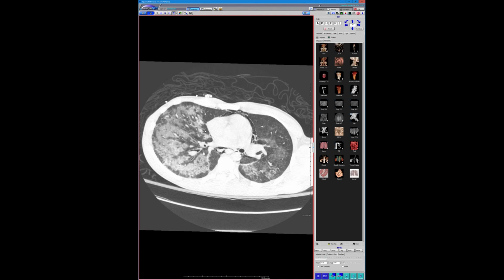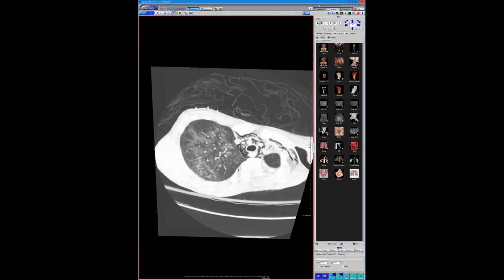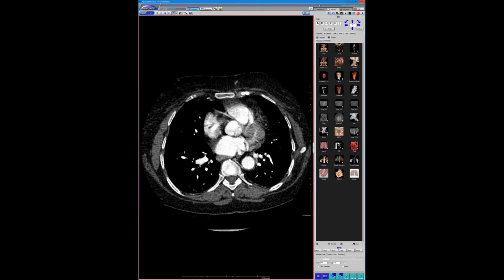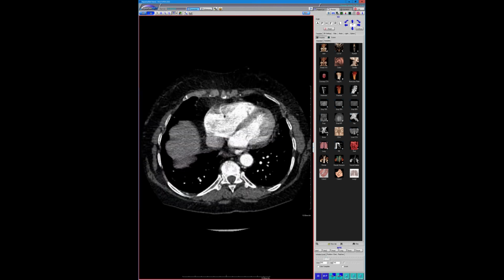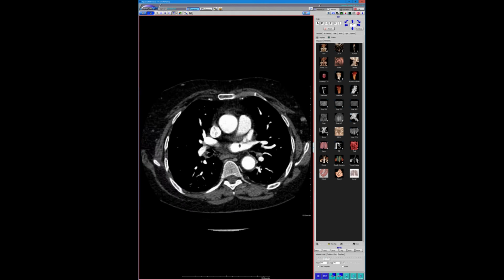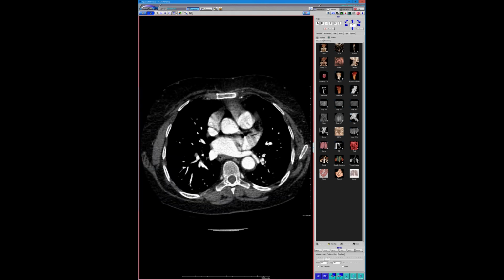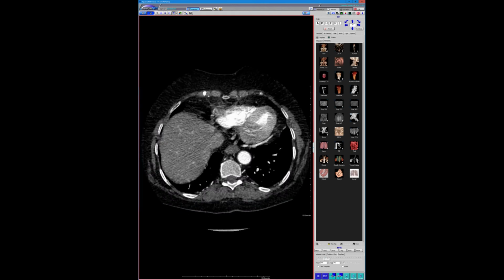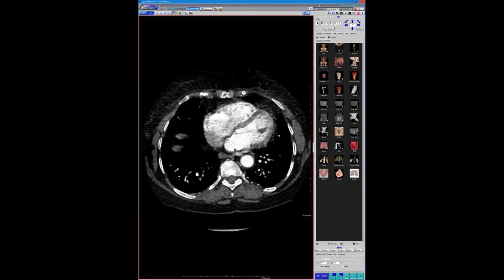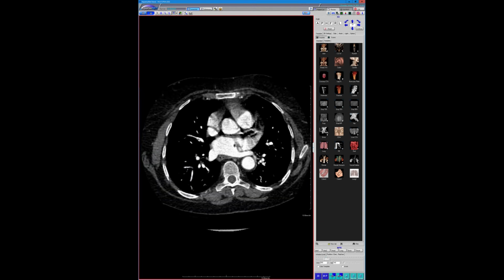They thought he had COVID and he continued to have shortness of breath and they got a PE study, which didn't show COVID or PE. But on the second study, my colleague read it and very nicely said, concern for inhalational injury such as EVALI. And then it turns out he vapes marijuana every day. So not gone yet. We're still seeing some cases. Very beautiful, a very classic case of EVALI.